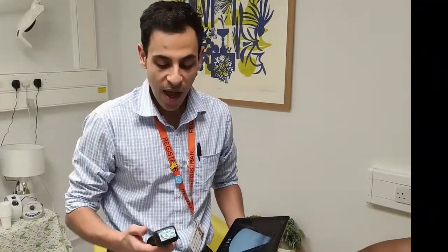Hi, so just imagine that we've got a patient at home and we want to gain a bit more information about their fluid status. So what I'm going to do is use the ultrasound probe to scan the patient and gain some more information about how wet their lungs might be, how much intravascular volume the patient has, and if the patient is in any renal obstruction.